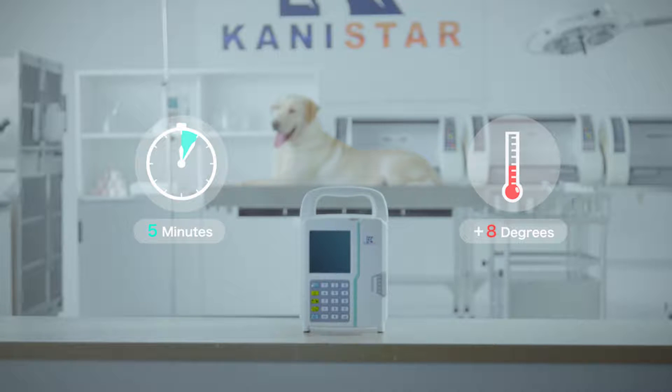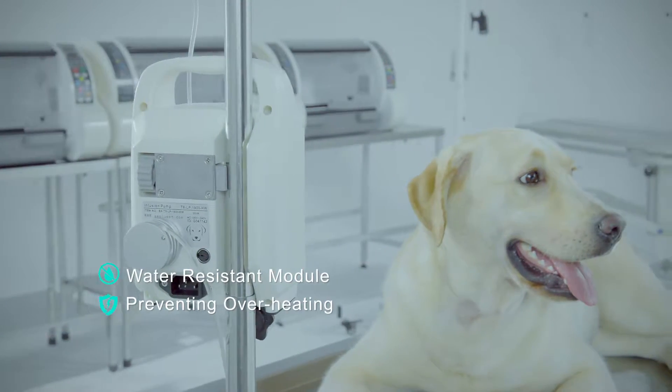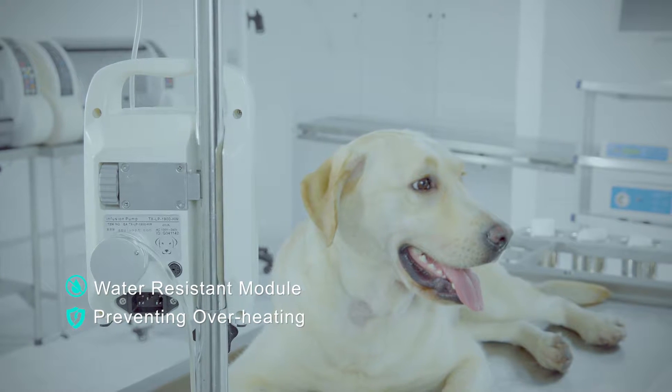It will heat up most fluids by 8 degrees in less than 5 minutes. This water-resistant module is equipped with a built-in detector that prevents overheating, ensuring safe operation of the device.